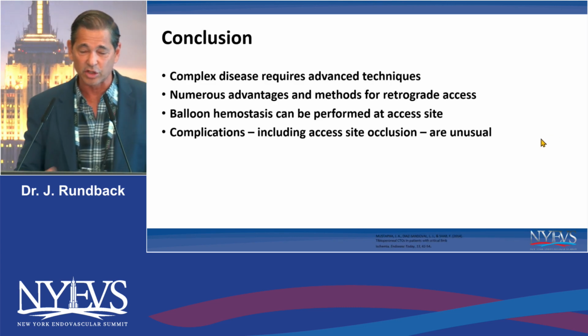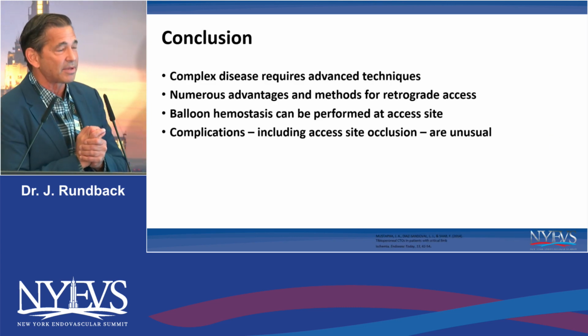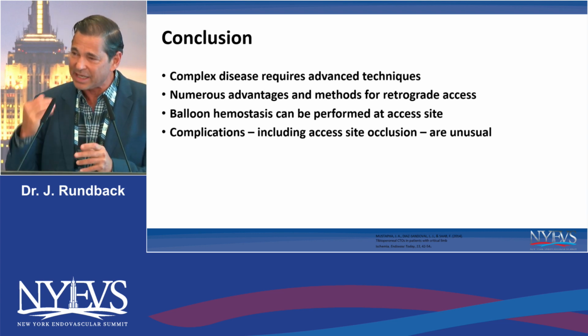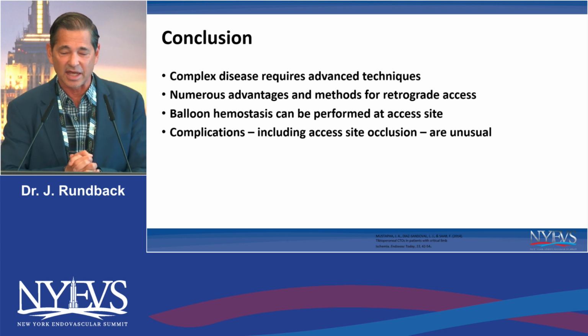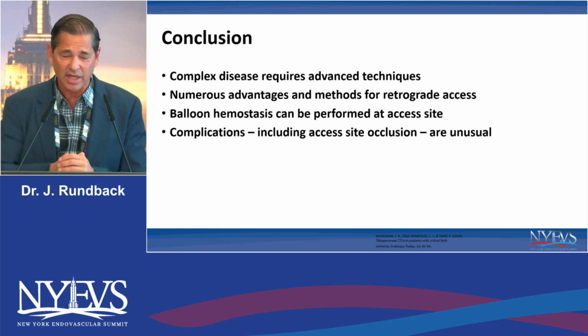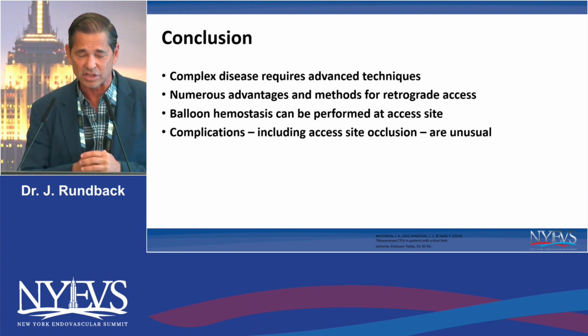In conclusion, obviously we're treating more and more complex disease and more difficult patterns of anatomy. This requires advanced techniques. Pedal access is here to stay. It has numerous advantages. It's very, very safe. You can do balloon hemostasis, which I didn't talk about, and access site occlusion is very, very unusual.